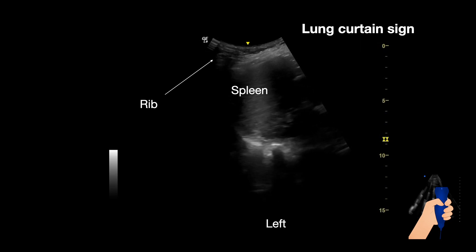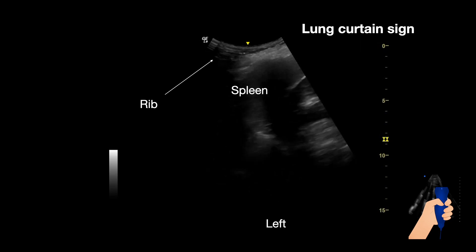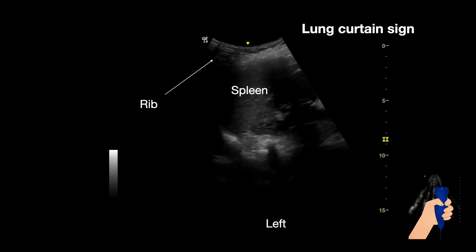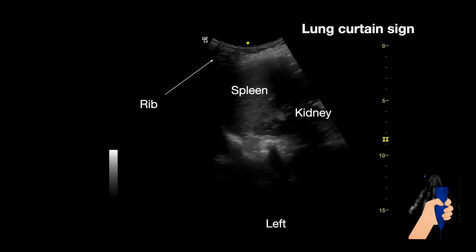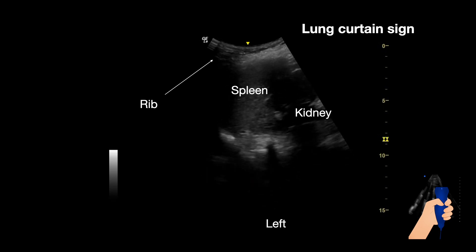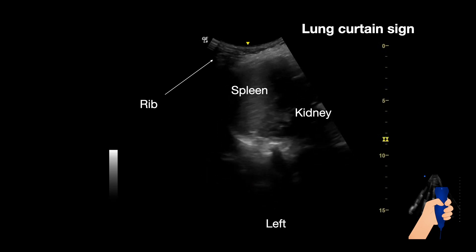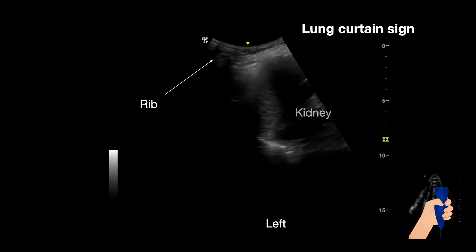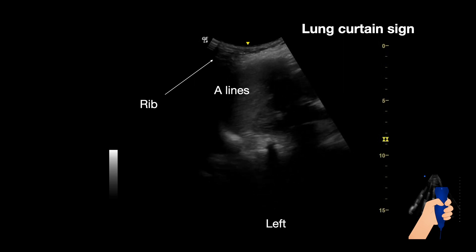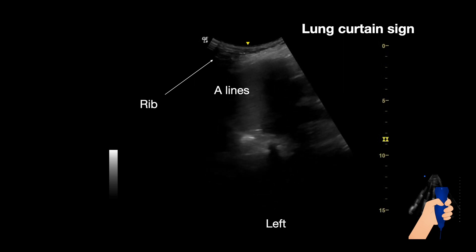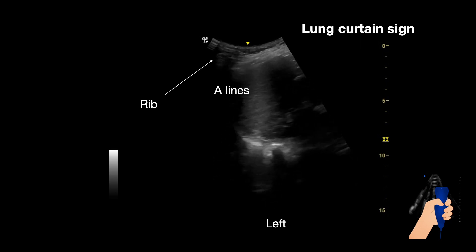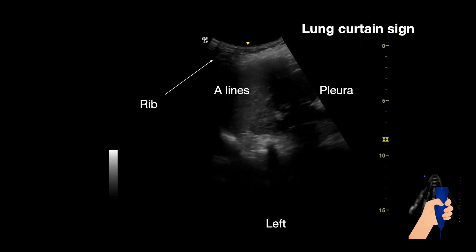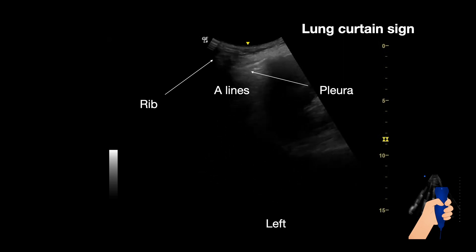The structures here are the spleen coming in and out with normal breathing, and a kidney coming in and out of the visual field with normal breathing. Then we can see A lines coming in and out with normal breathing. And lastly, the pleura sliding back and forth.